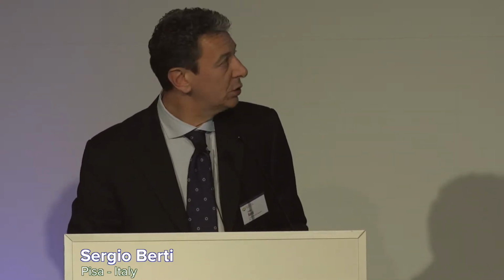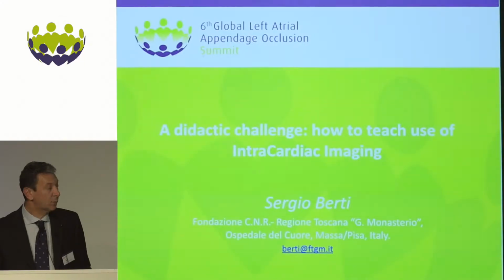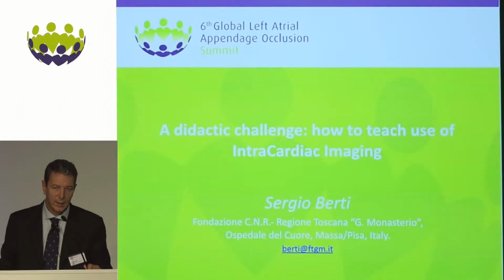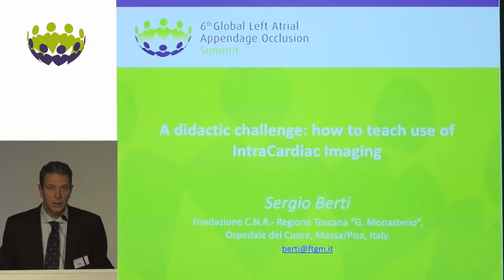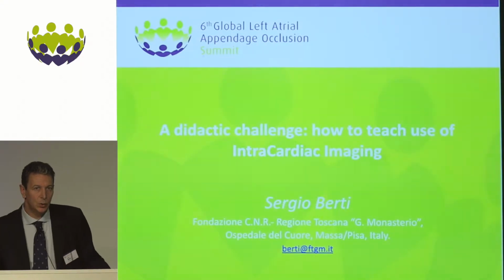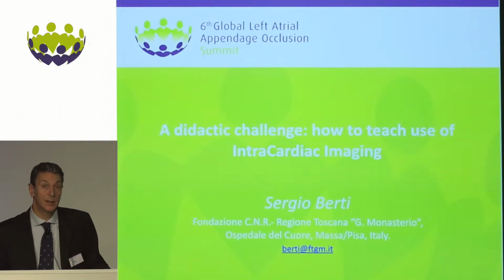Really, my presentation is propedeutic to the next presentation, in which Eric Nielsen will show a practical case of LAA closure procedure using the ICE.